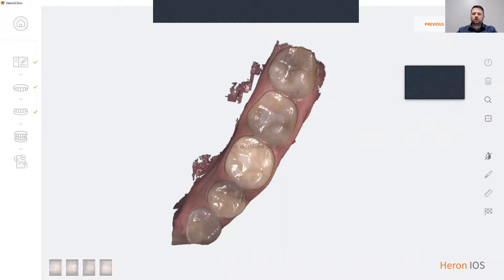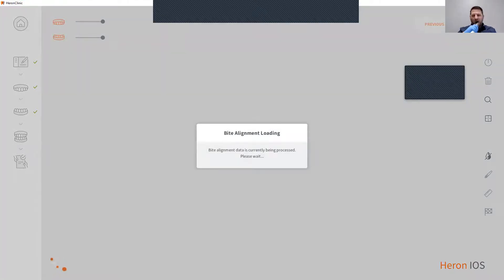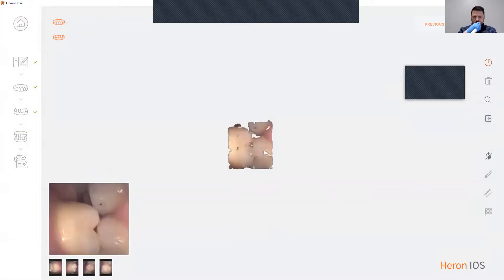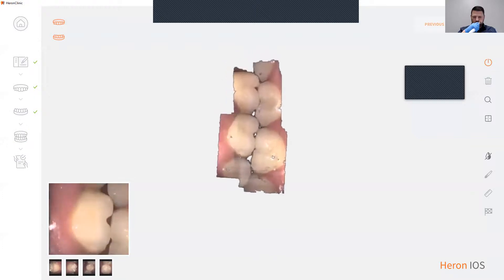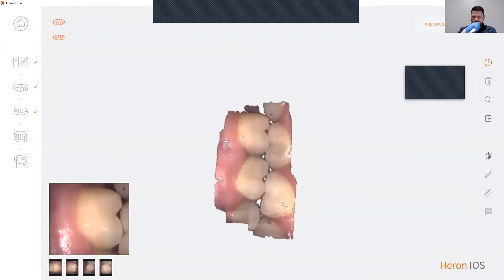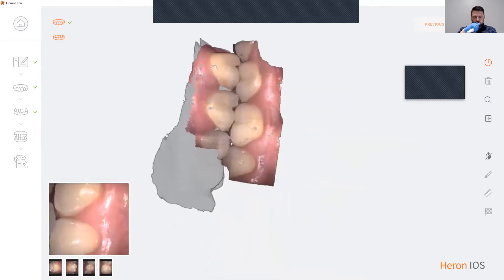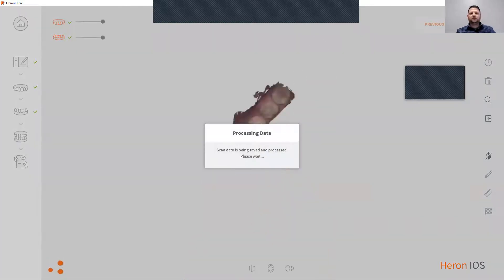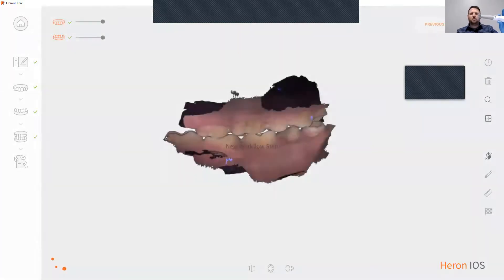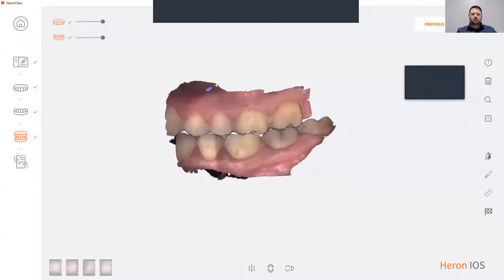Now to scan the bite, click next. Once the bite has locked in, the scanner automatically turns itself off and you now have your bite scanned.